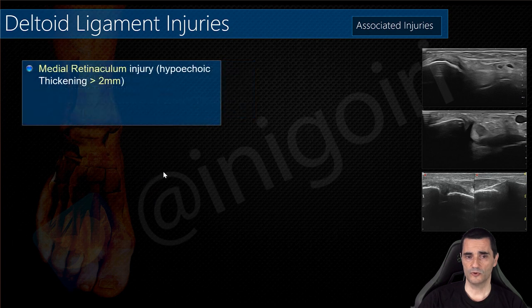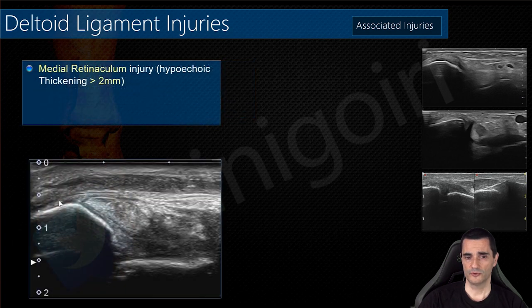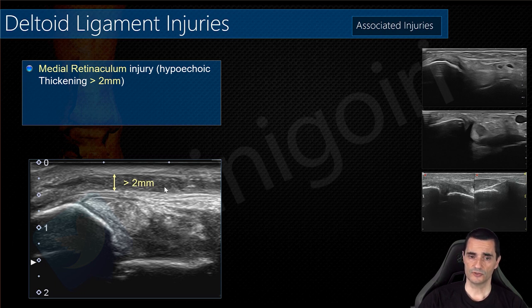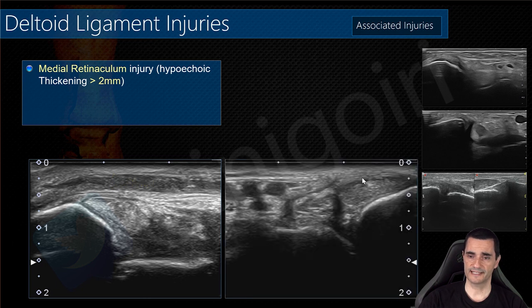Always check the medial retinaculum. The retinaculum insertion is in the periosteum of the tibia. Here is the posterior tibialis tendon, and above it you can see this thickening and hypoechogenicity — a torn retinaculum with more than two millimeters of thickness. You can measure the thickness or compare with the contralateral side — the normal contralateral side shows a very thin retinaculum.